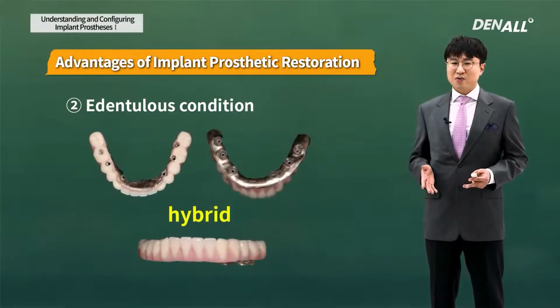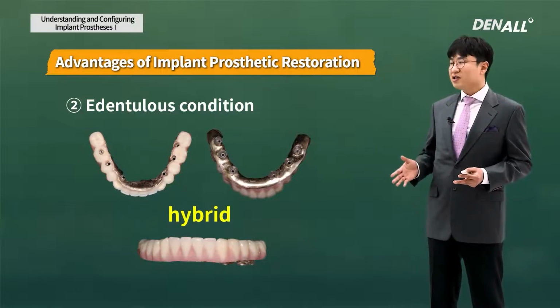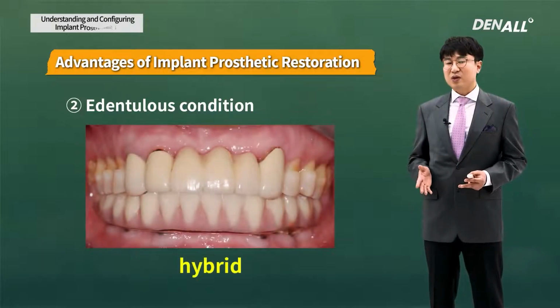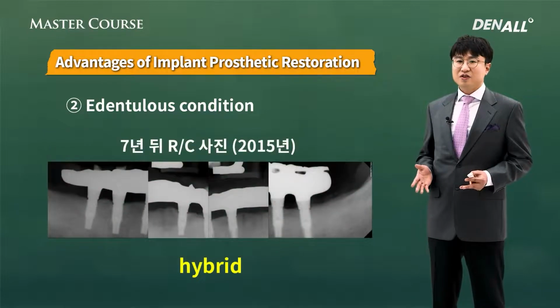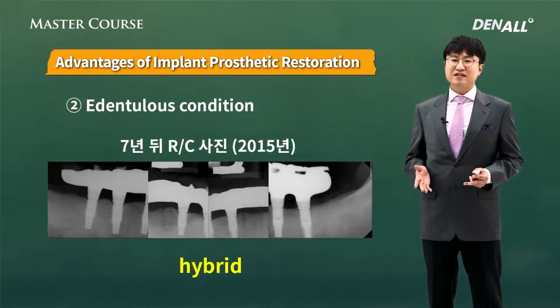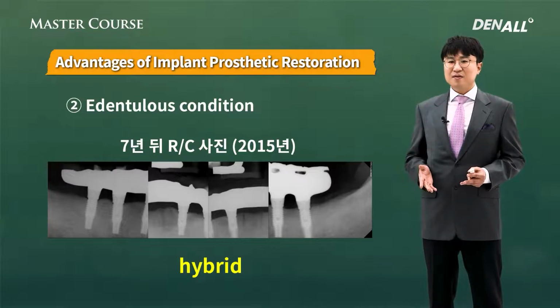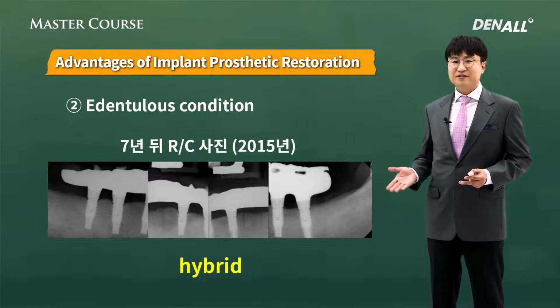Oral hygiene is hard to maintain, and as we have customized abutments now, we don't use this type anymore. But if you look back, with the hybrid type that you used to use, thanks to implants, for a long time patients could masticate very satisfactorily. So in the edentulous condition, again, implants can improve the quality of life of patients. In the master course, I'm going to teach you more about this.